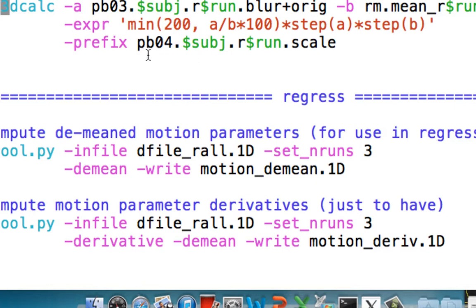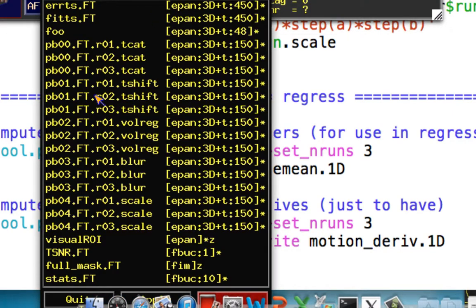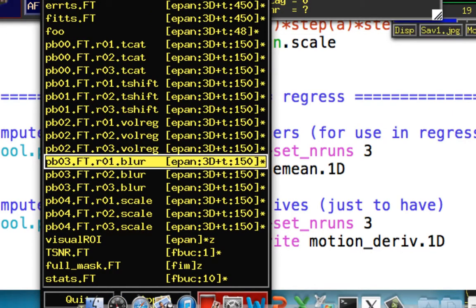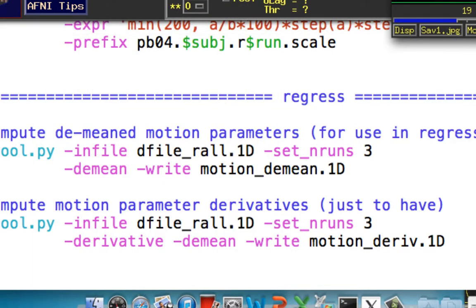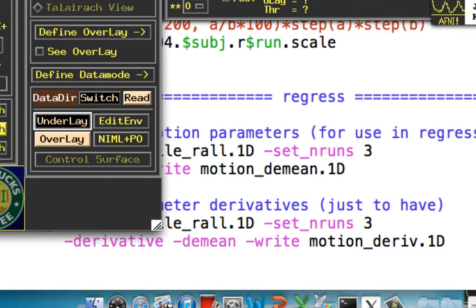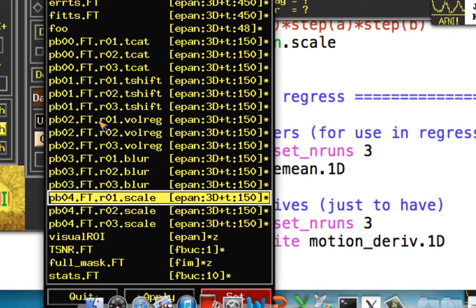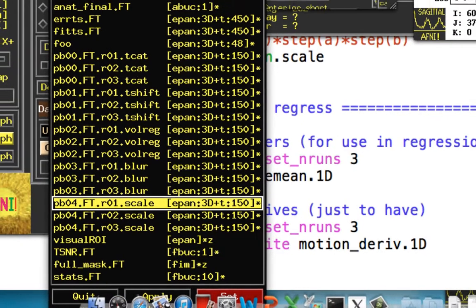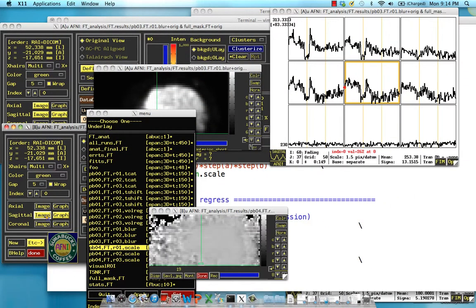So then it also puts this run.scale. So in this up above here, I'm going to put our blurred data set. Move the overlay, put the graph back up. So here's what it looked like. And down here, I'm going to put our underlay as this scaled data set. Let's see what that looks like.